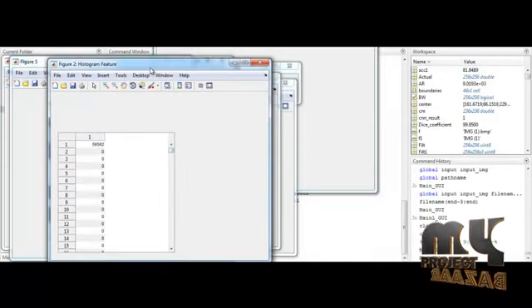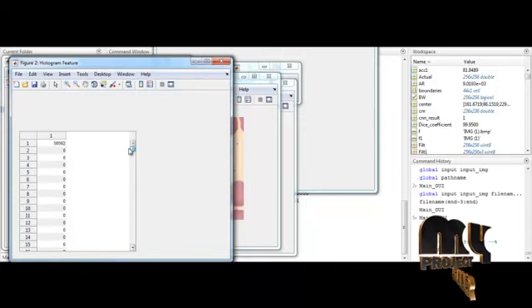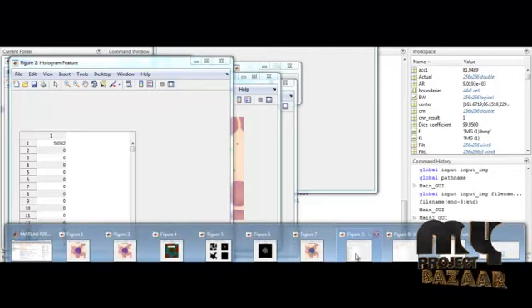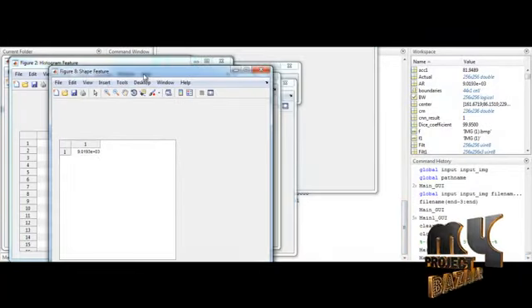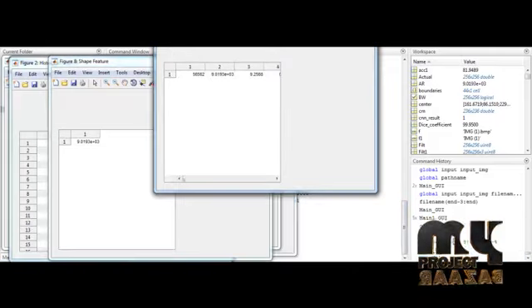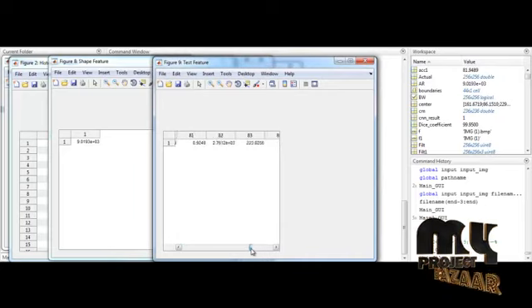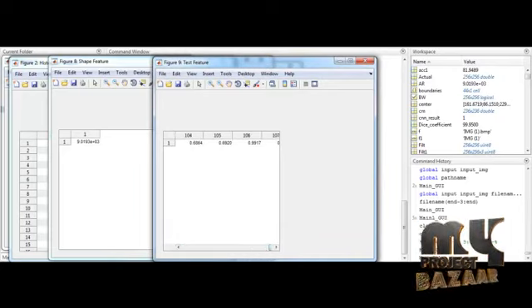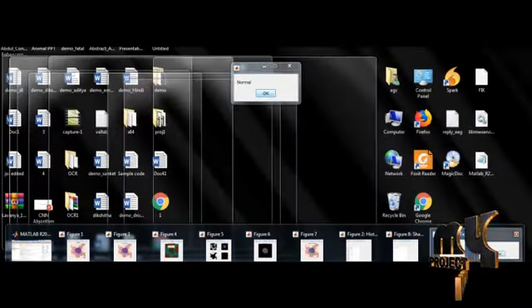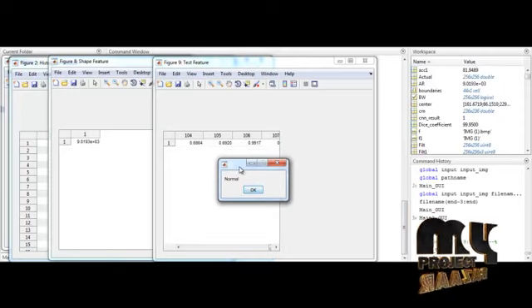After the segmentation portion, the feature extraction will be carried out based on the color. Here the color is extracted by means of the histogram features. Then the shape feature is extracted by means of the area. Then the texture feature is extracted by means of the GLCM feature extraction. Those values will be displayed in table format. After the feature extraction methodologies, the classification will be done. In this classification step, the image is determined to be normal or abnormal.